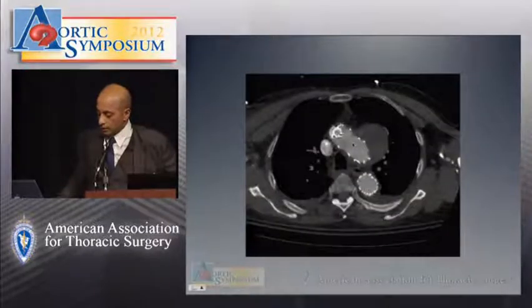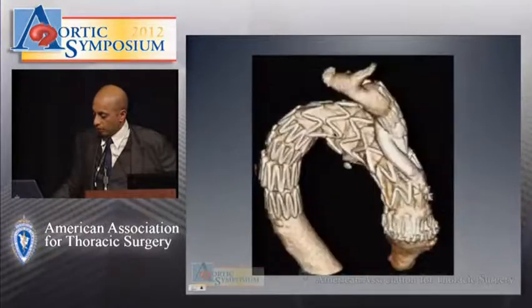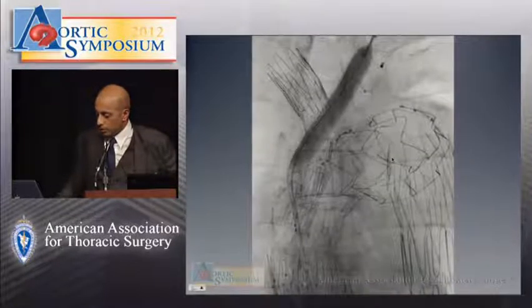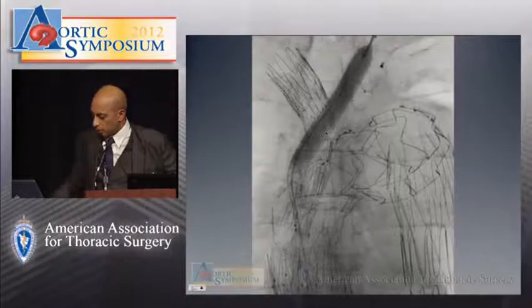Technically we had a good result, but on the postoperative CT, on postoperative day 2, you could see compression of the carotid branch, and in hindsight, it's not surprising why, because we reversed those branches. This was remedied with no problem with a balloon expandable stent, and this patient has done fine.